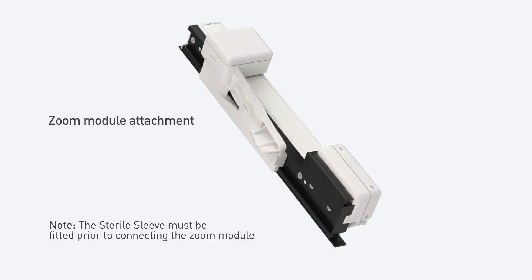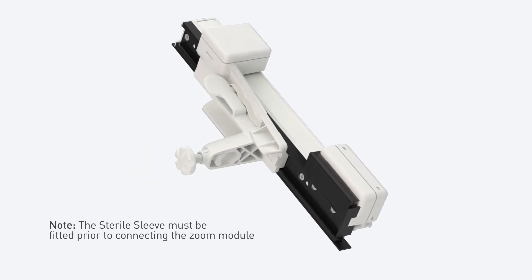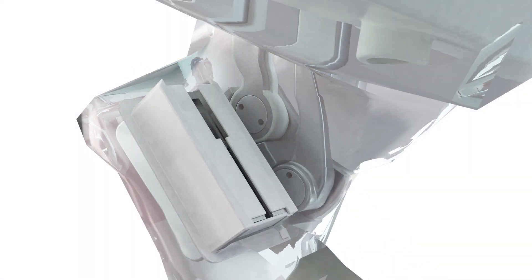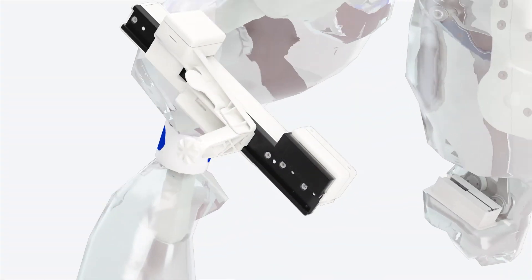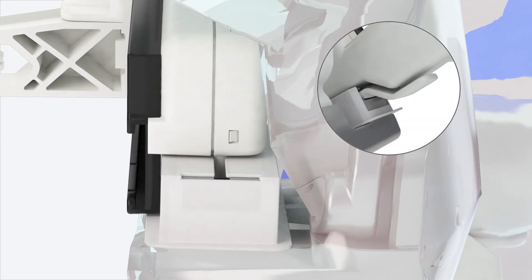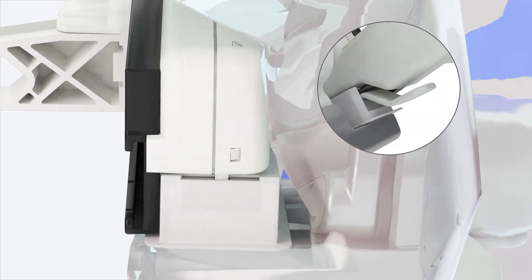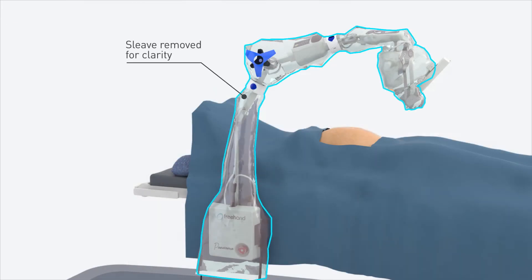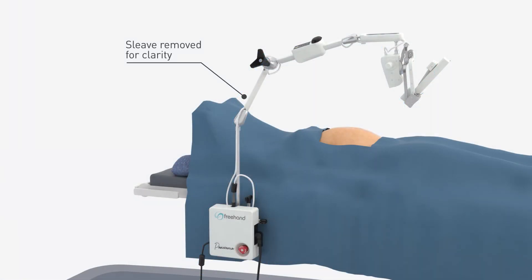The zoom module is prepared for attachment to the tilt assembly by first connecting the camera quick release clip. On the sleeve, remove the blue gasket tab and then proceed to attach the zoom module. The zoom module is carefully lined up with the foot grooves of the tilt assembly and then eased down until it locks into place. Please note that the sterile sleeve has been removed for clarity in this section.